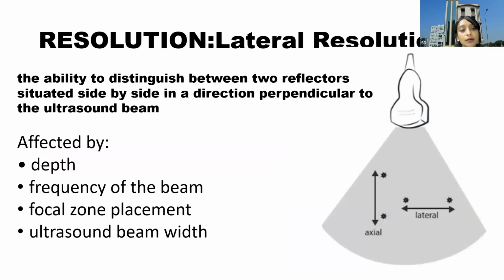Then resolution. Resolution is mainly lateral resolution and axial resolution. Lateral resolution means the ability to distinguish between two reflectors or two objects which are situated side by side at the same depth. So lateral resolution is affected by depth. It is affected by the frequency of the beam.